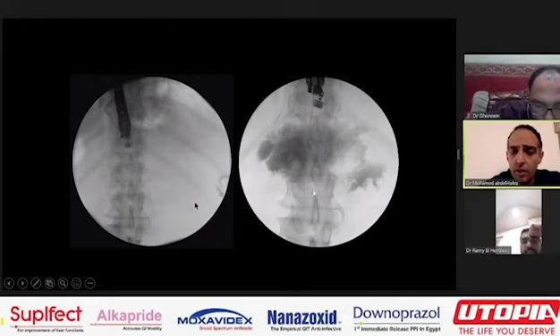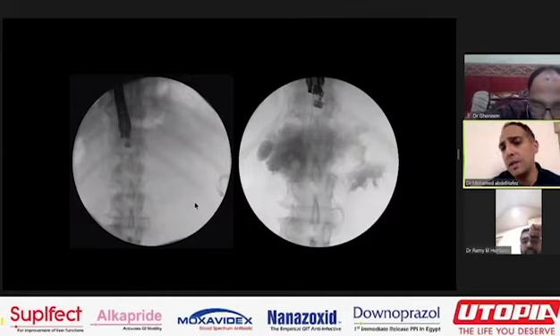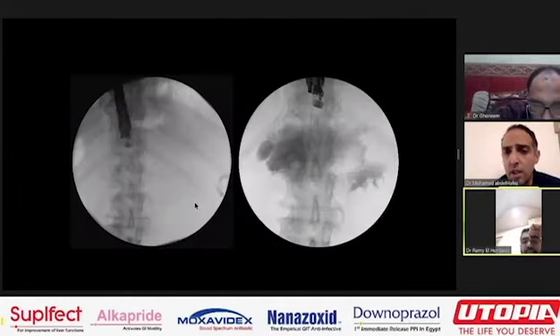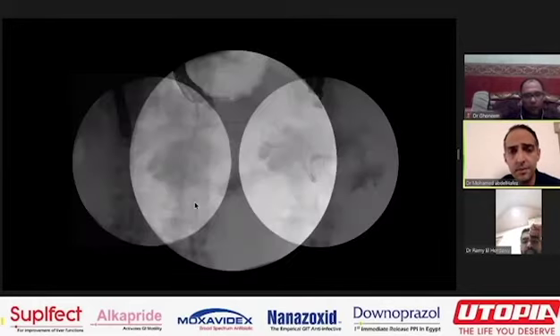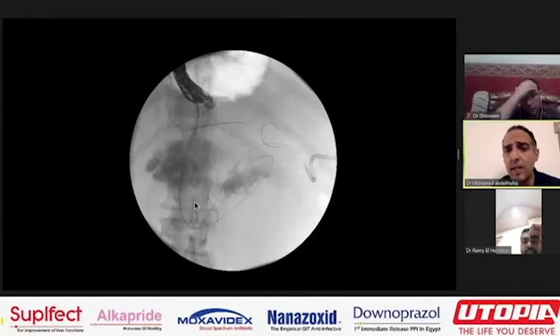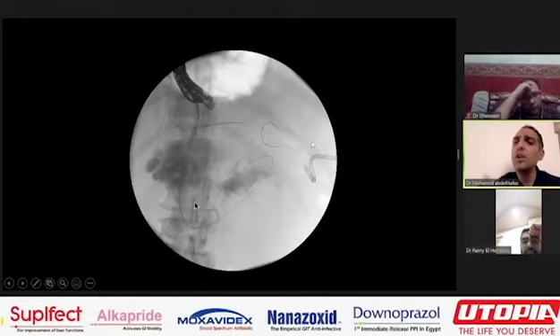You give contrast. First thing you have to do is to withdraw or aspirate a few milliliters for microbiology and culture. And then you give contrast to make sure that you are in the right collection. I have also witnessed people puncturing the gallbladder many times, thinking it was the cyst. You put your wire, make sure that you make 2 loops at least with the wire. You see the wire is looping twice because you will do many maneuvers in the next few minutes and you don't want to lose the wire. So keep it deep in the cyst.